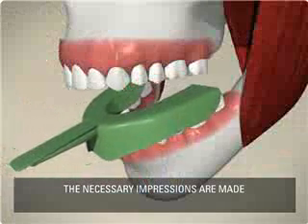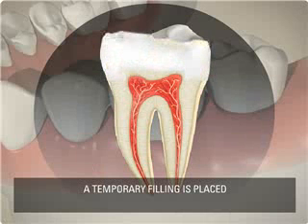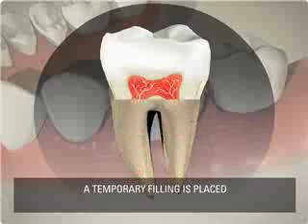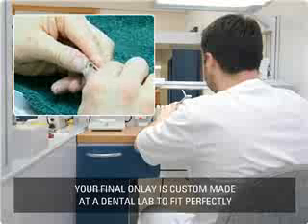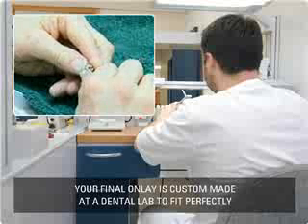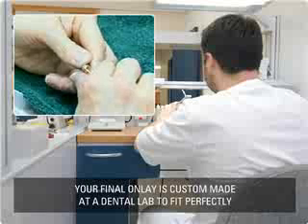Impressions are taken to model the exact shape required for the onlay. A temporary filling is placed until the final onlay is ready. The onlay is custom made at the dental lab. Your dentist will tell you how long this takes and schedule a time to complete the onlay restoration.